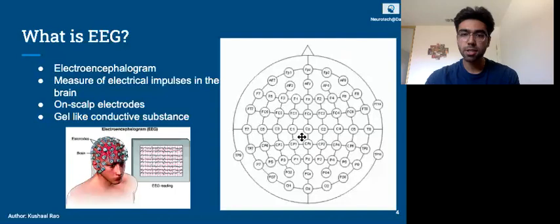If you pay attention closely, these labels at first glance might seem like gibberish, like they don't make any sense, but they're actually not terribly hard to follow, and it's kind of intuitive if you know a little bit about the brain and the anatomy. So if you look at C over here, C refers to central. If you imagine this as a 3D surface, this is at the very middle, and then you have it going laterally across the side.